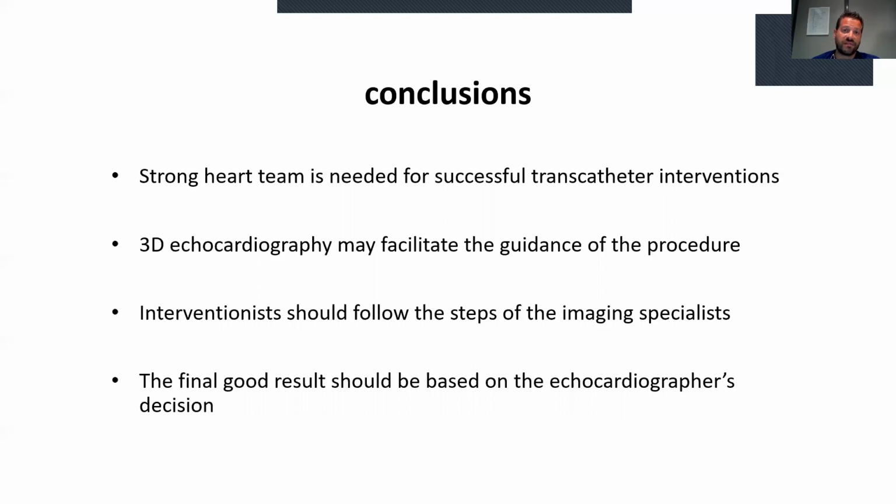And of course, the final call for releasing the device and finalizing the operation is on the echocardiographer, who should check all the rims, should check the stabilization of the device, and say that we have a good result and we can release the device.